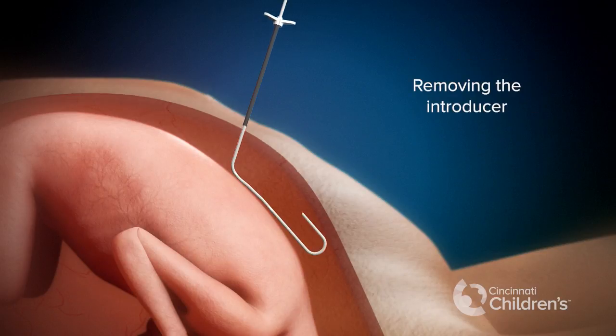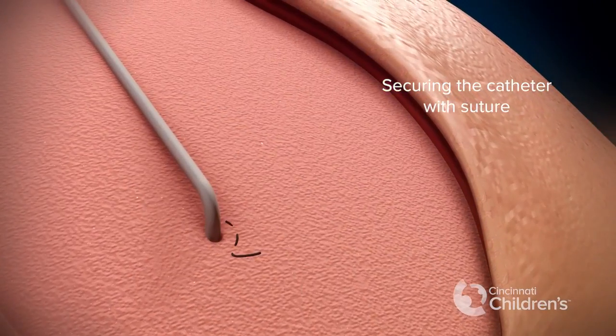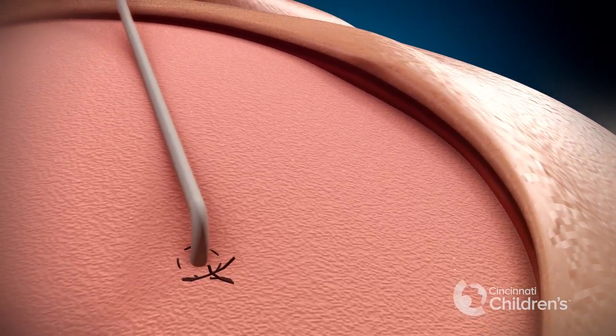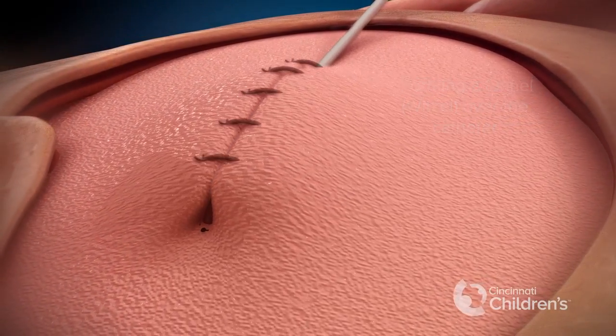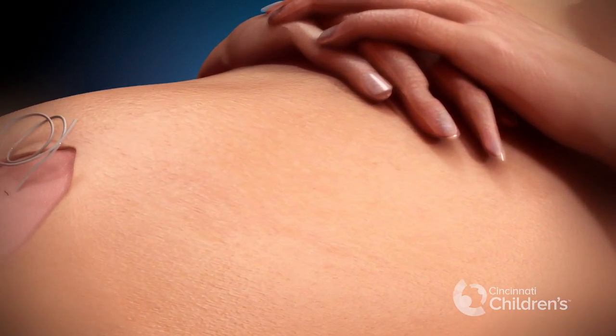The introducer is removed. The catheter is first secured to the uterus using a purse string suture. Following the purse string suture, the uterus is folded over the catheter for a length of about five centimeters. This is similar to a Witzel tunnel used in other operations.